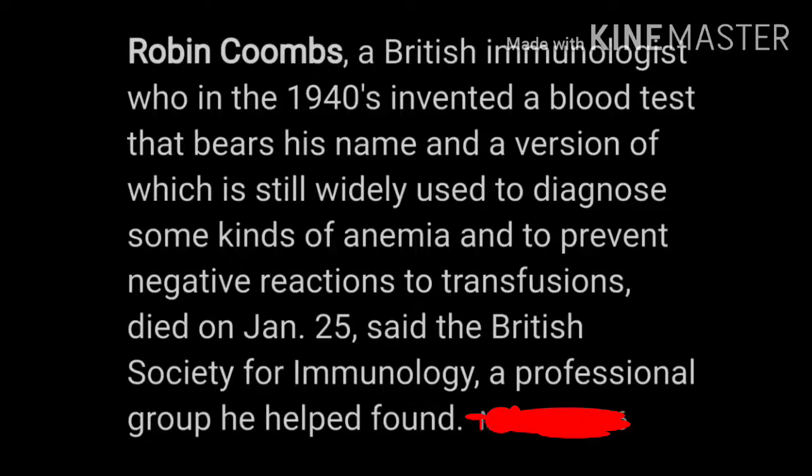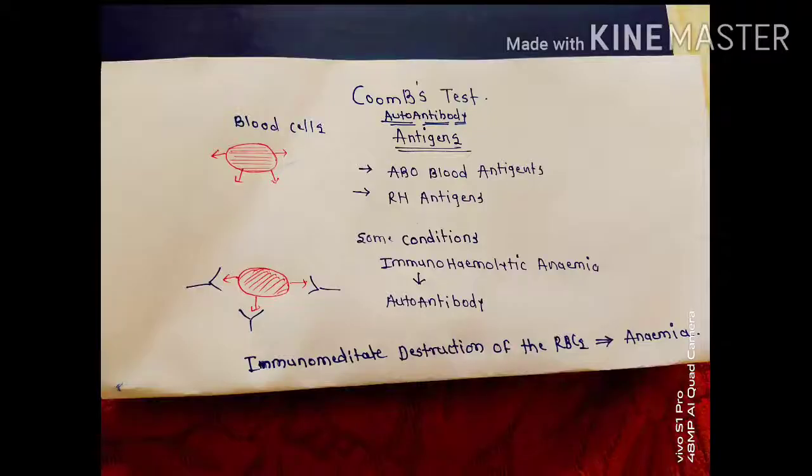This Coombs test was invented by Robin Coombs for the diagnosis of some kinds of anemia and to prevent negative reactions during transfusion of blood. This was the intro of the Coombs test. Let's start discussing the Coombs test.